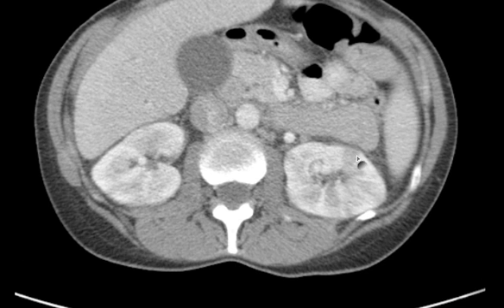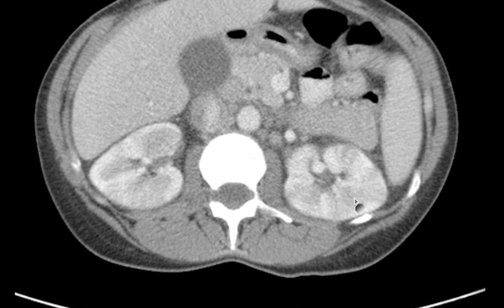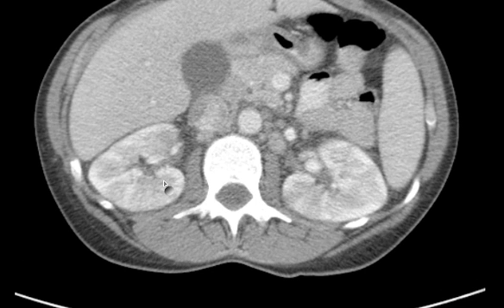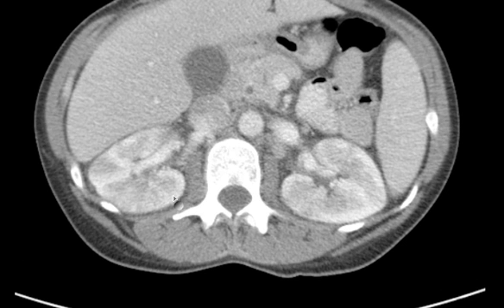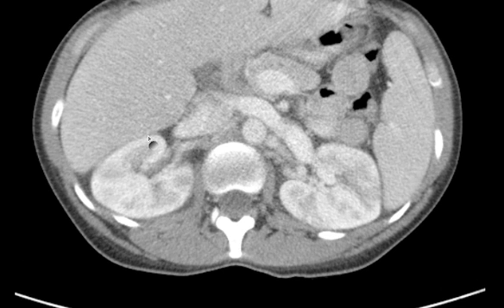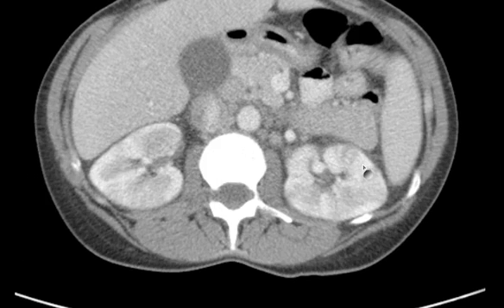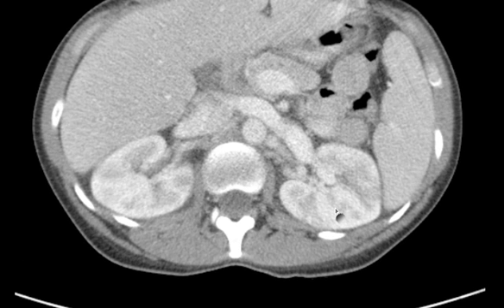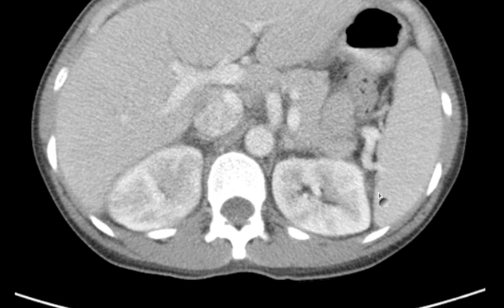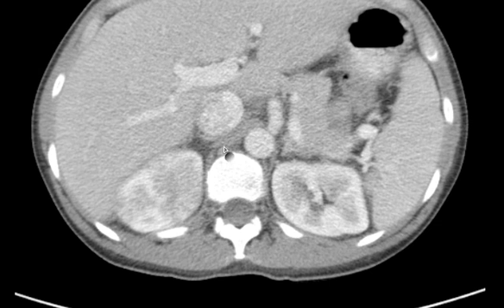Here you see an example where the cortex enhances normally up to here, then not, and then here it's enhancing again. There's no good reason for that — that's abnormal. That's pyelonephritis. As you look more and more, you start seeing broad sweeps of cortex that do not enhance normally — like all along here, and here, and here. Going up from there, now you have some good areas of cortical enhancement, but this is not quite right, this is abnormal. Both sides show a defect in cortical enhancement. This whole area here is abnormal.